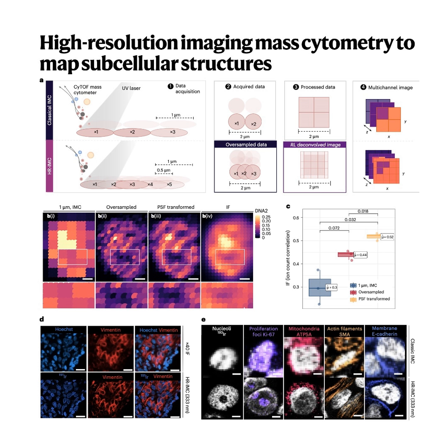And the key advantage there is what IMC doesn't use. Light. Exactly. Because it sidesteps traditional light microscopy, IMC eliminates the two massive technical headaches that plague methods like immunofluorescence, or IF. Okay, what are those? First is signal interference from autofluorescence. That's the glow that a lot of biological tissues just naturally emit. And second, cycling artifacts, which happen when you have to repeatedly bleach or remove antibody layers to see new things. IMC is a clean, one-shot staining workflow. You do it once. So we get clean data, high multiplexity, reliable tracking of dozens of targets at once.